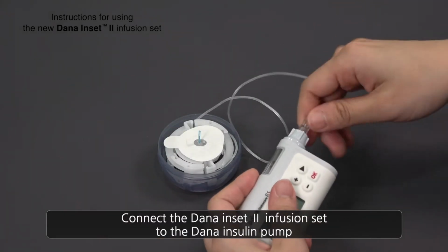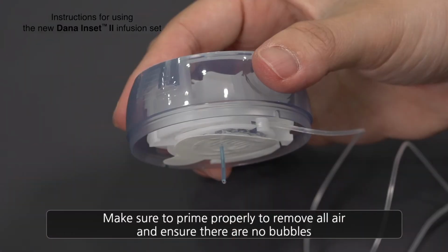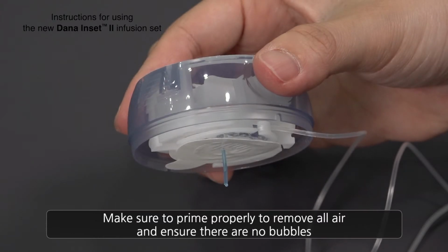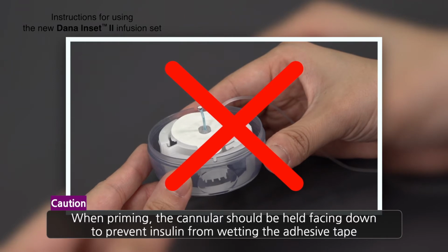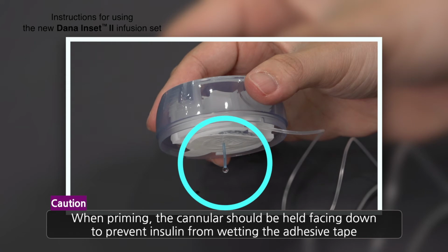Now, connect the Dana Inset II infusion set to the Dana Insulin Pump. Make sure to prime properly, removing all air, and ensure there are no bubbles. Caution: whilst priming, the cannula should be held facing downwards, to prevent the insulin from wetting the adhesive tape.